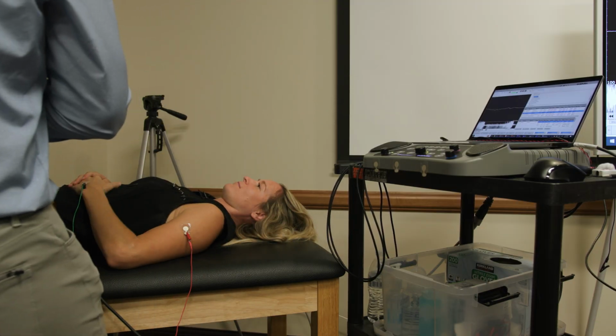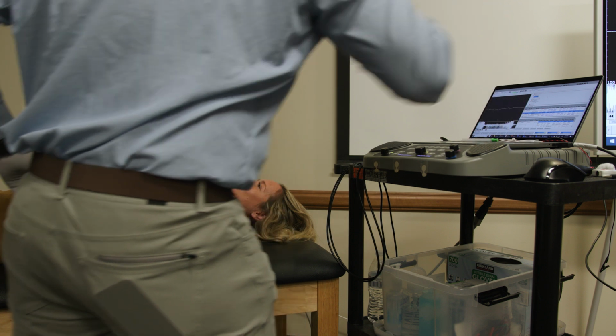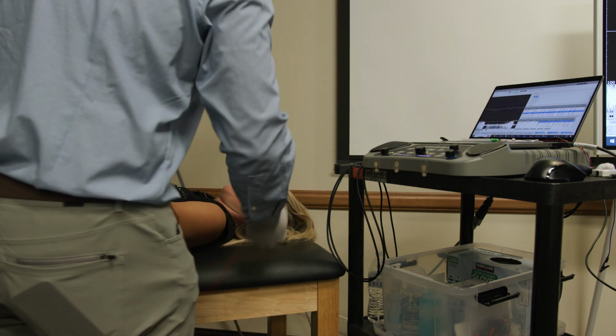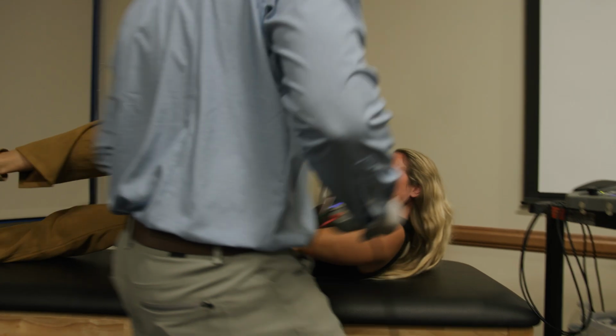All right, don't look as I recap a needle. All right, so let me get you unhooked, Brandy, and you can tell us again kind of what the EMG needle portion feels like.